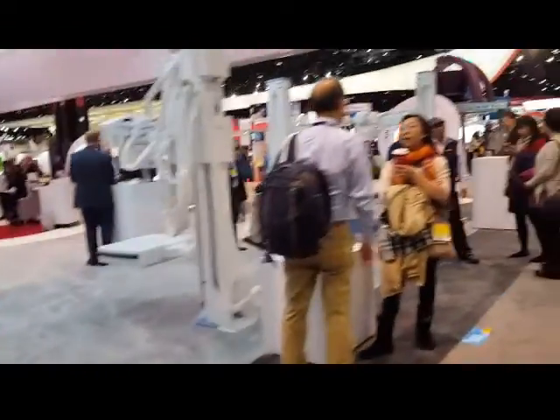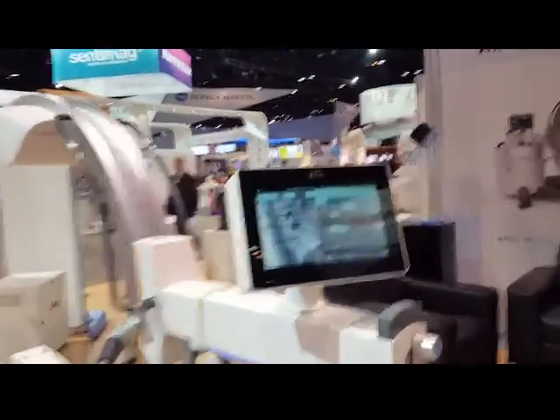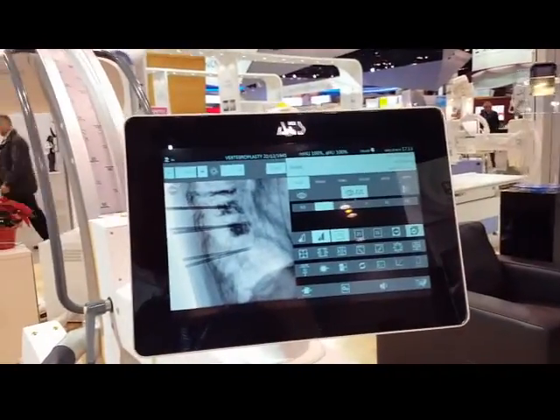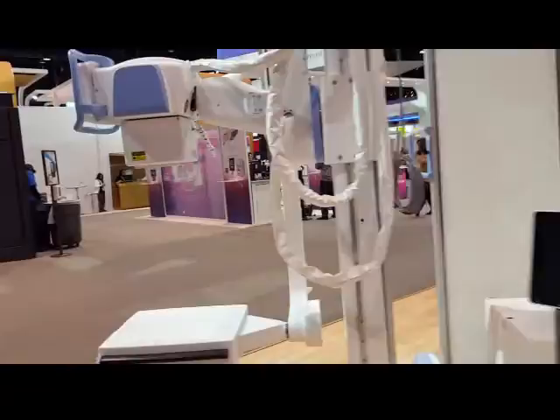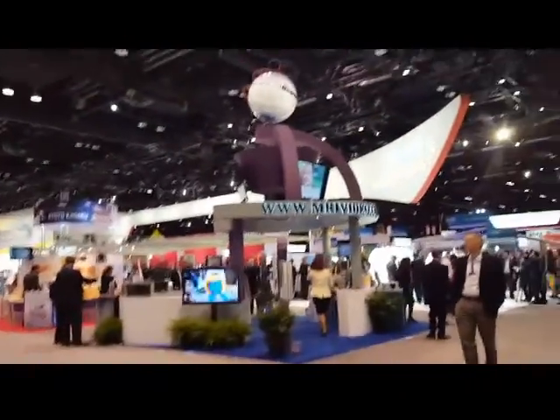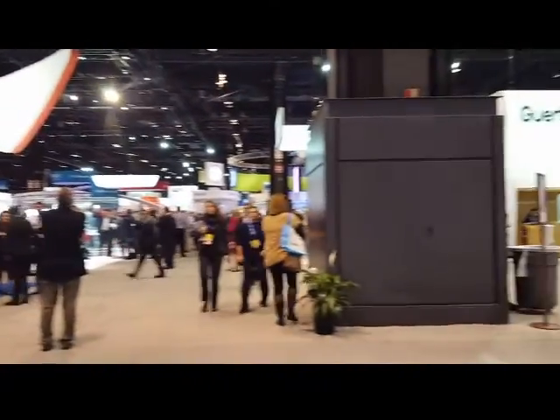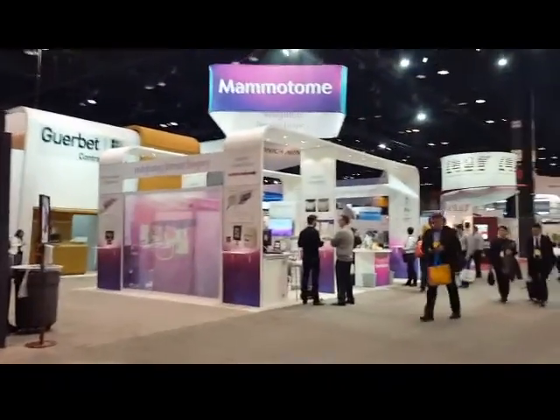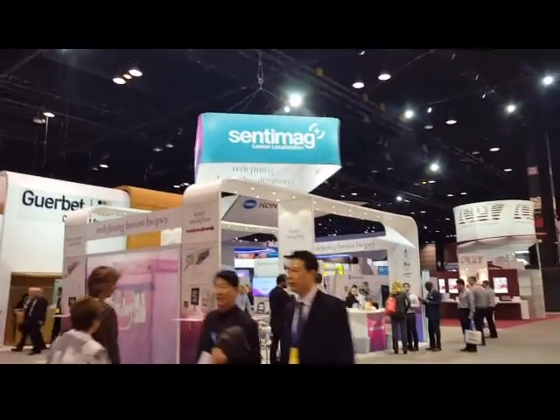More x-ray machines. It's like a car show. C-Arm. Mammotome — I think that's the one that we used to use on biopsies where we work.